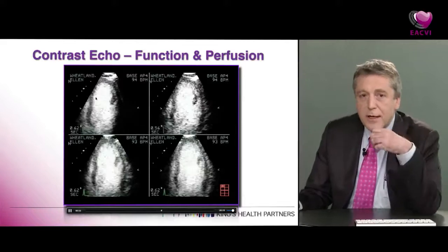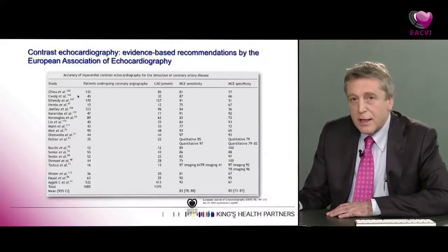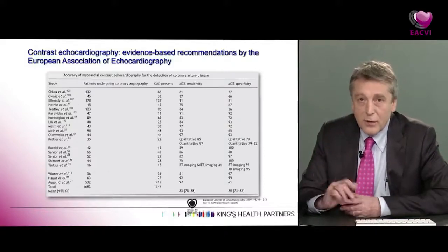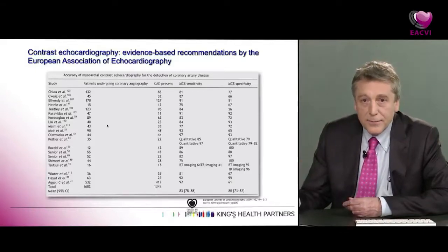And this has been demonstrated, and there's been extensive research on this, and Roxy has published quite a few papers on this, as you can see, showing that there is very good evidence for incorporating myocardial contrast echo within your standard contrast stress echo protocol, because it does give you incremental value.